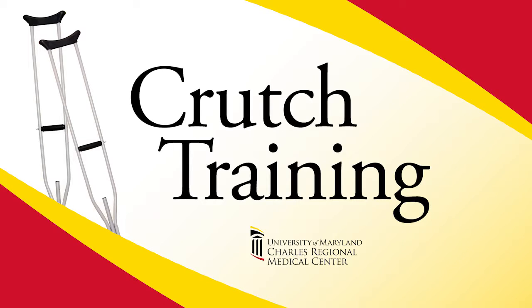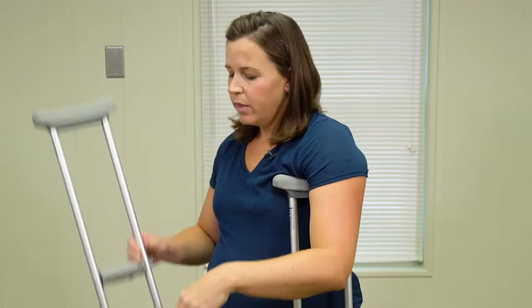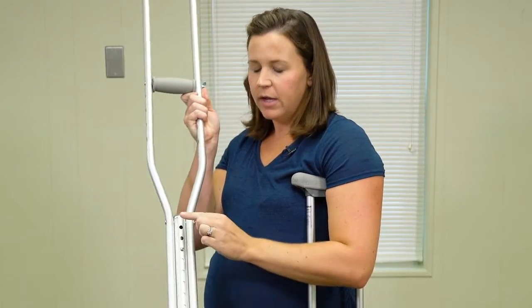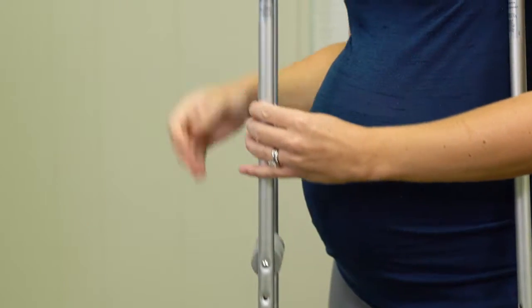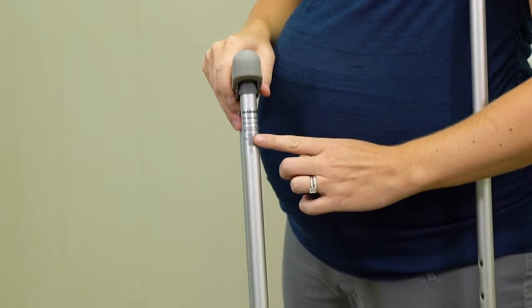Crutches are an important tool that can be very useful after you injure your leg or after surgery. We're going to show you some different tips and helpful information that can help you properly use them and help to keep you safe. Your crutches come in all different sizes. On the bottom of the crutch, you will find different height measurements, as well as on the side, a sticker that will indicate the weight limit measurement.